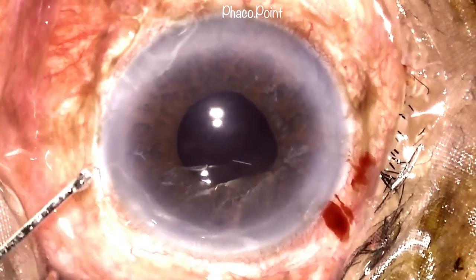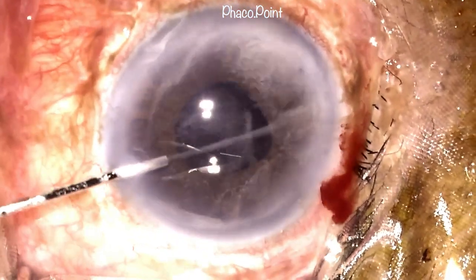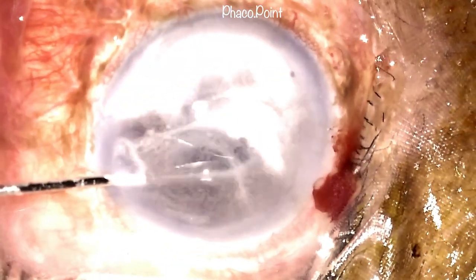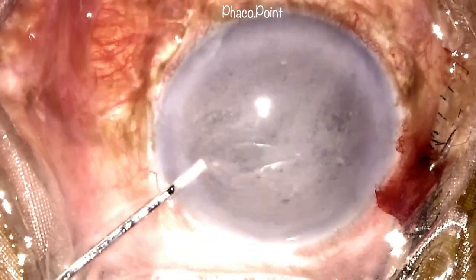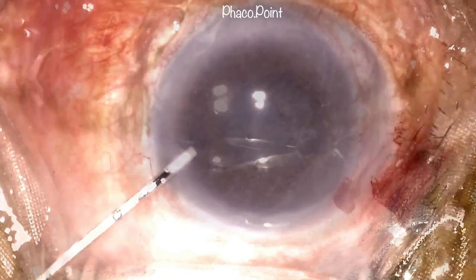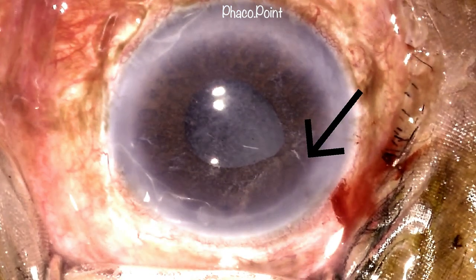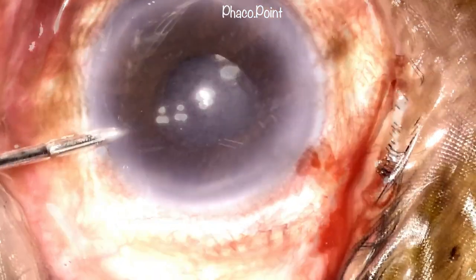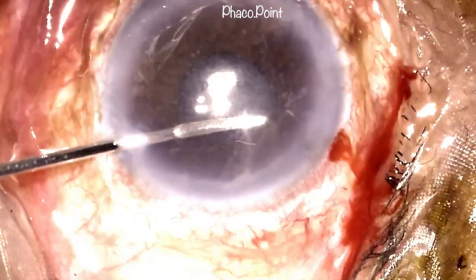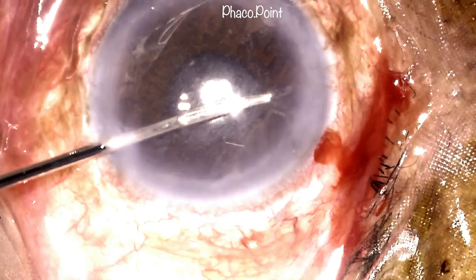Having done that, diluted triamcinolone acetonide is injected into the anterior chamber to clearly delineate this vitreous strand and also to pick up any other vitreous disturbance should it exist. Clearly, you can see that there is a single strand of vitreous at, say, the 10 o'clock position. After fixating the globe, an intraocular scissors is introduced from the 1 o'clock paracentesis incision and it goes and cuts the strand in one snap.